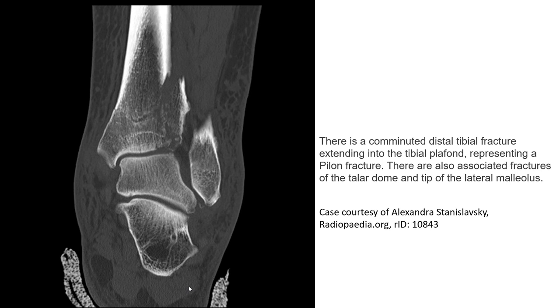Another example on CT of the ankle shows a comminuted distal tibial fracture extending into the tibial plafond, representing a pilon fracture. There are also associated fractures of the talus and the tip of the lateral malleolus.